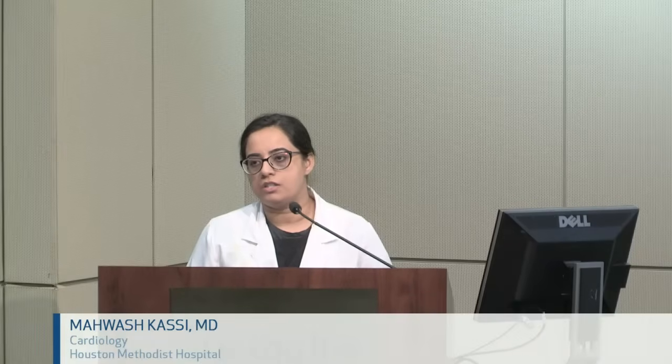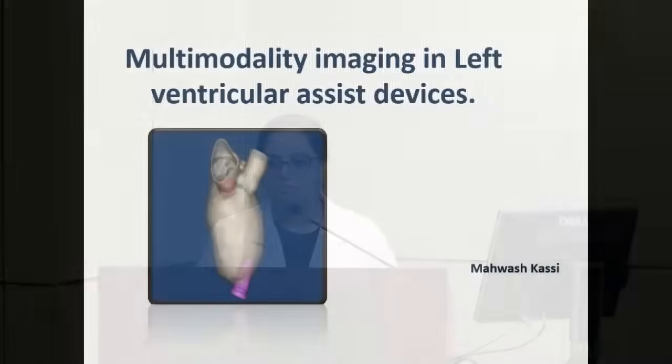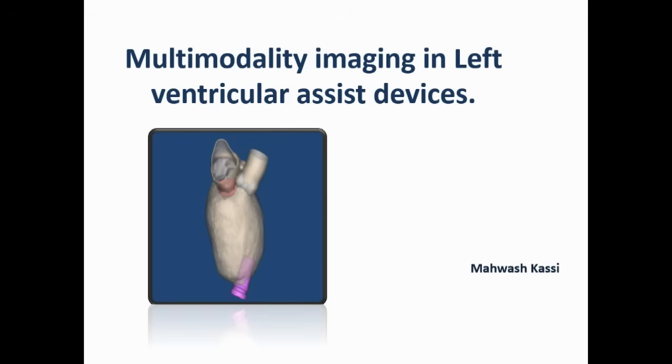We have sonographers here that I worked with, and the way I think about echocardiography in LVAD patients is as a point of care test. So when we order an echo, we're making a decision right there and then about what we're going to do with the LVAD speed or what kind of complications we're dealing with. Most times I would encourage all sonographers to just give me a call when you're at the bedside. We've done this with multiple sonographers, and we've got really good things on echo, which I have some images for, and we can talk about those a little bit more.